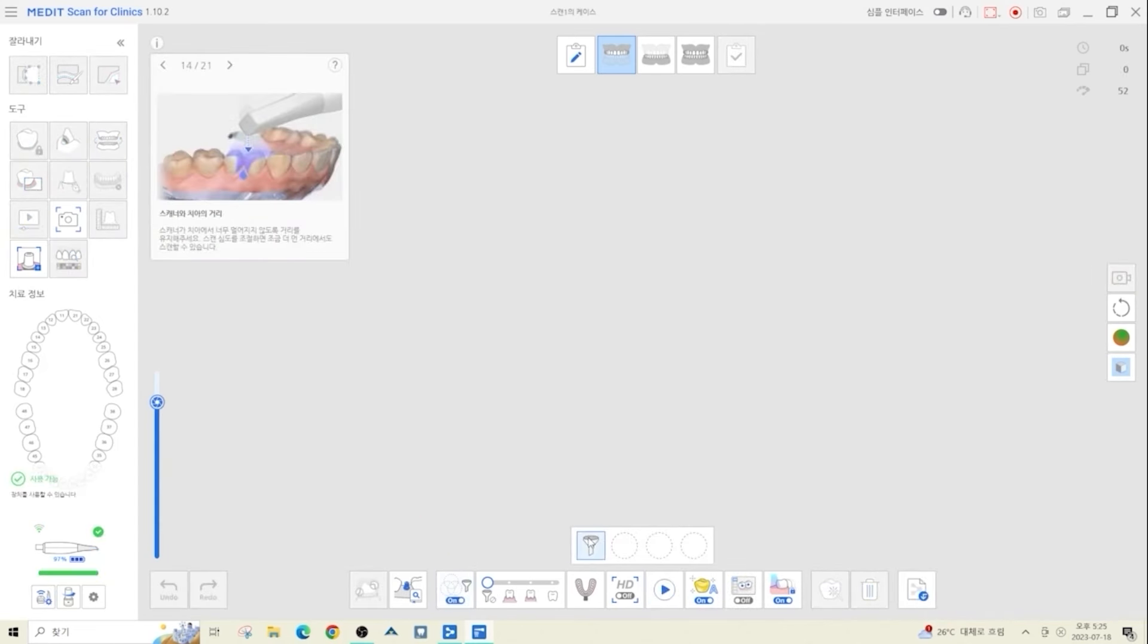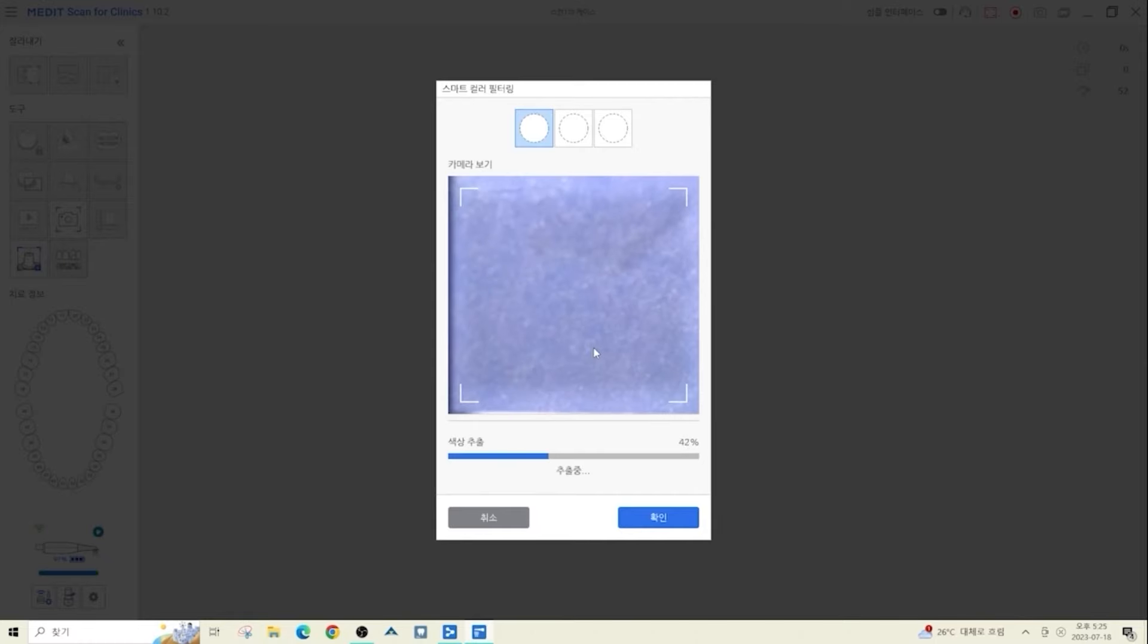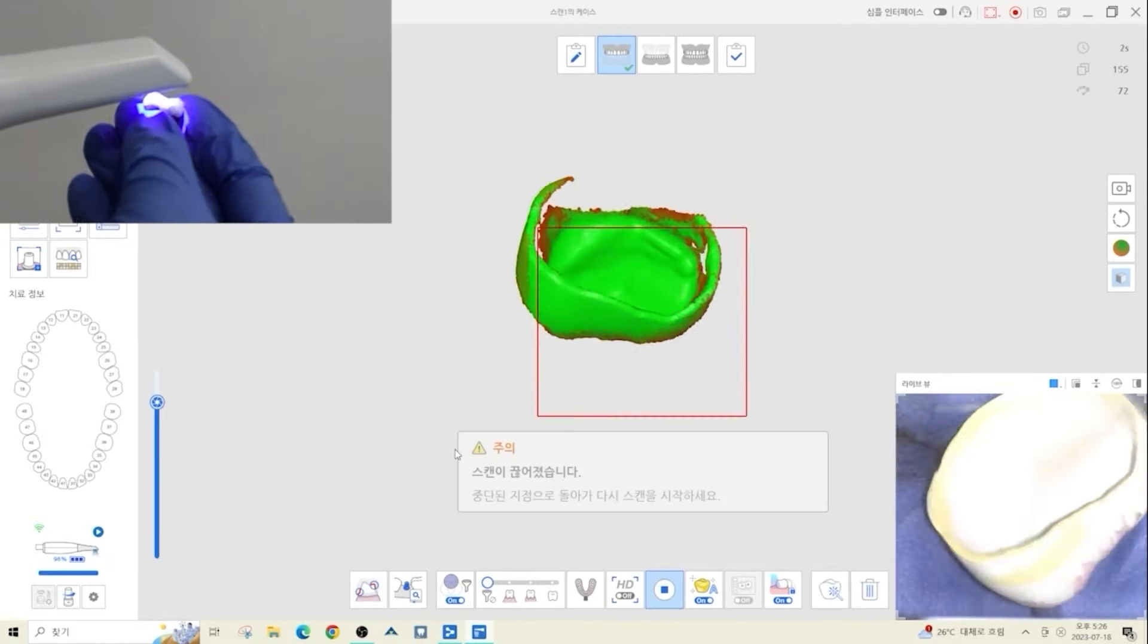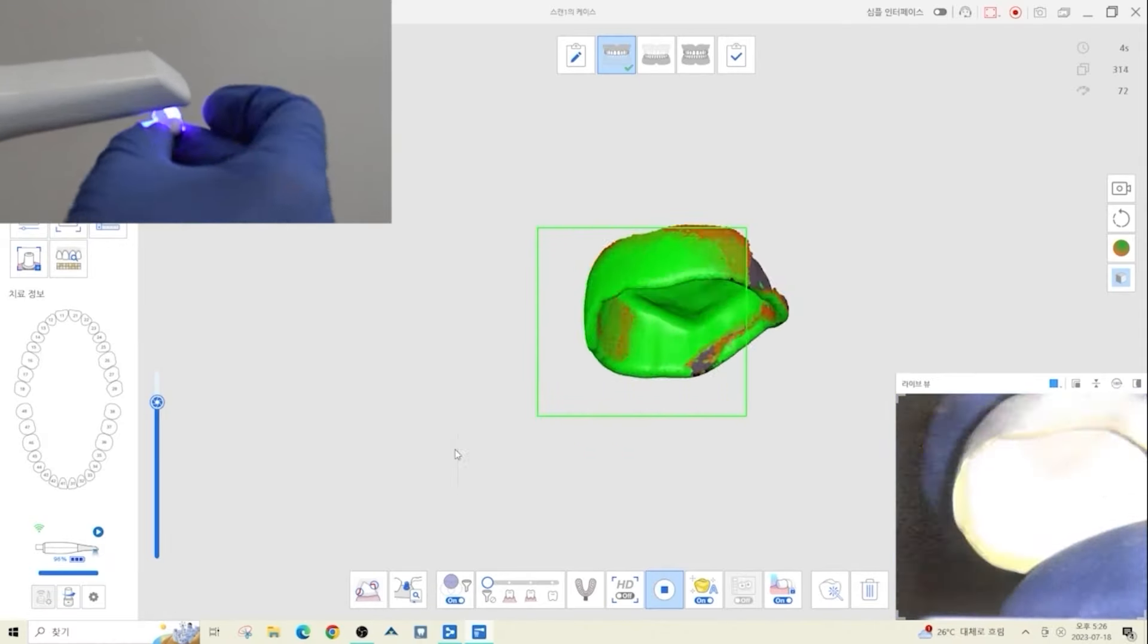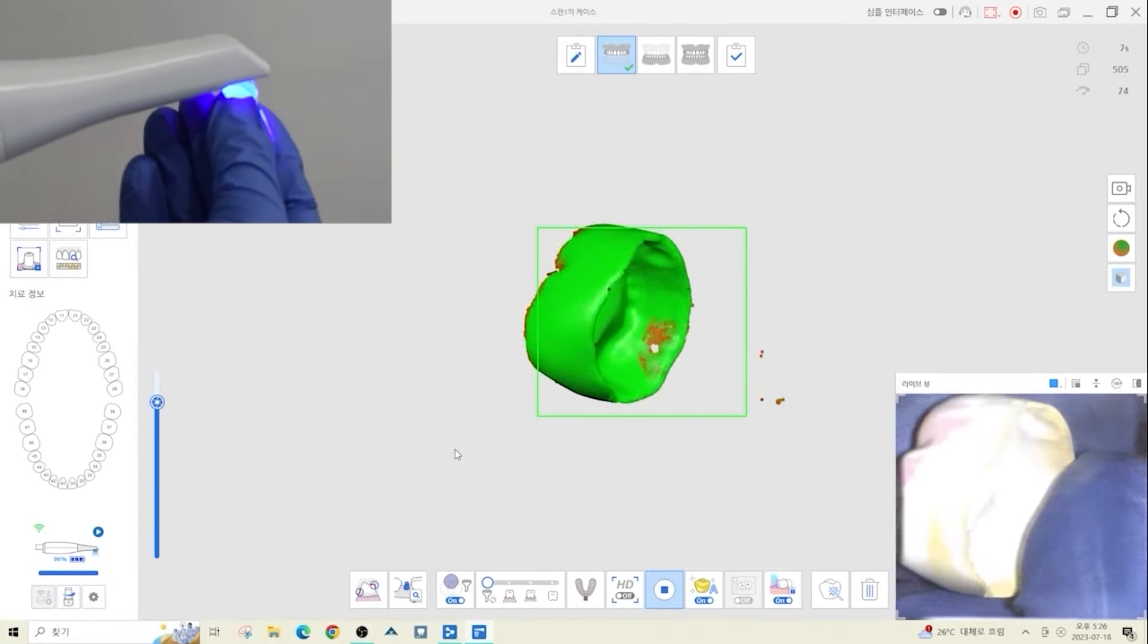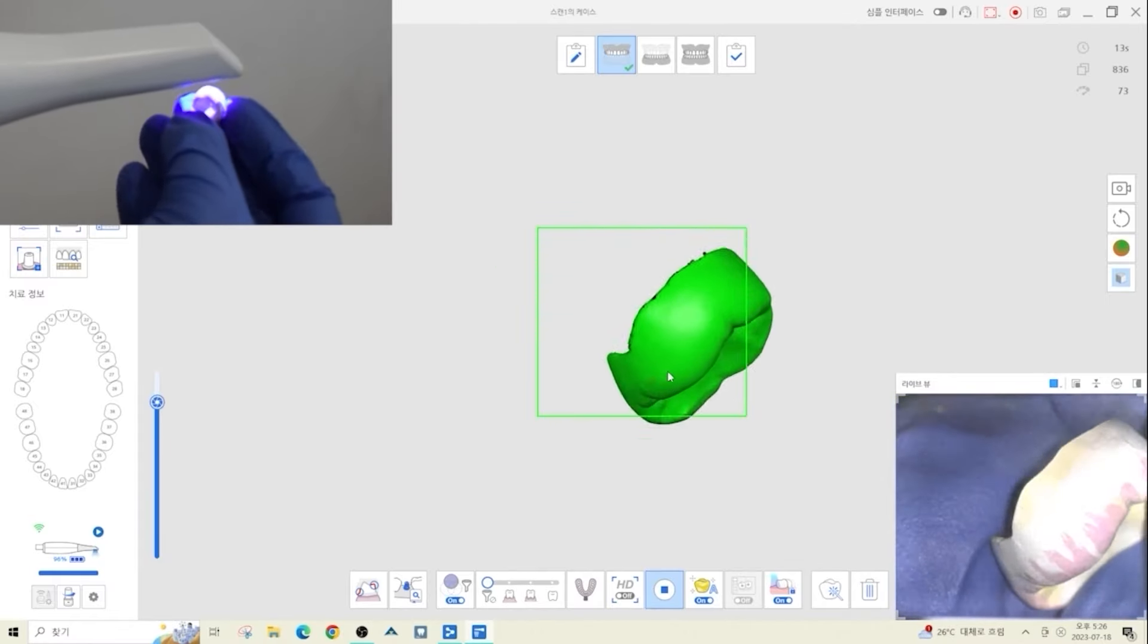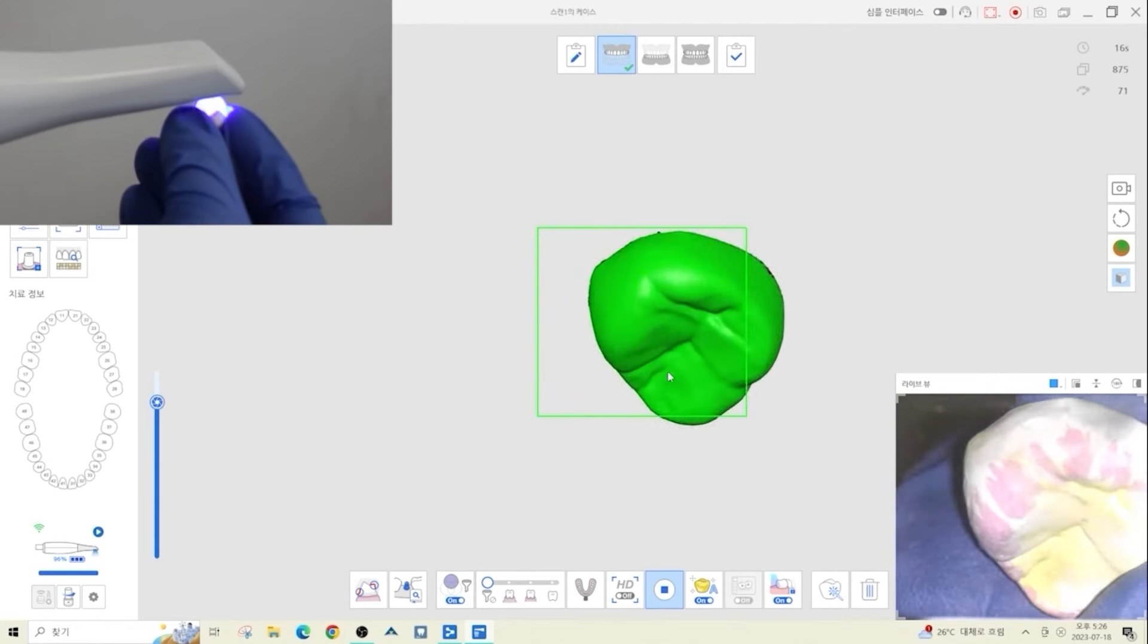First, click the smart color filtering feature. Press register colors, then start to extract colors. After enabling smart color filtering, the registered colors will be erased while scanning. When scanning crowns, it is recommended to turn off all other filters except smart color filtering.